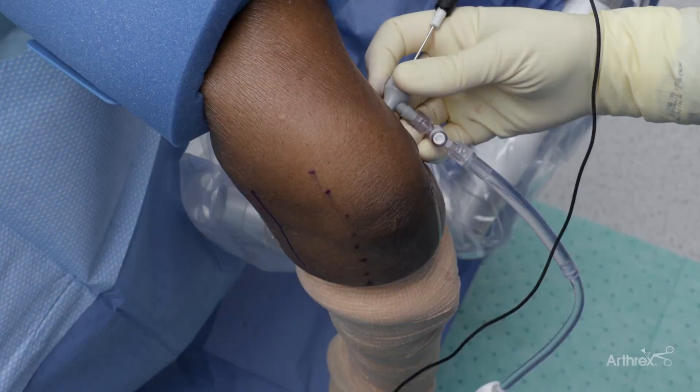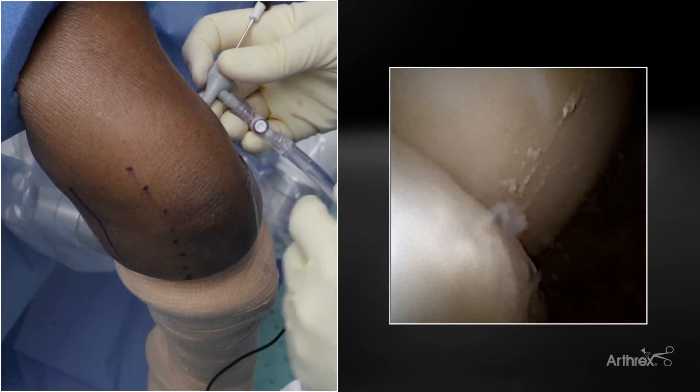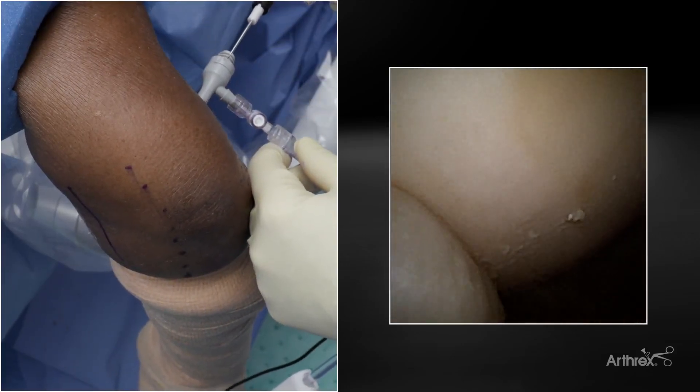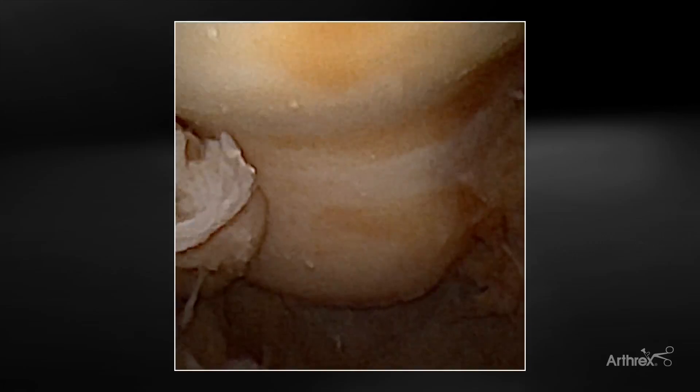You can see that we have an excellent view of the ulnar aspect. This is a zero-degree camera, so we see an excellent view of the coronoid and an excellent view of the trochlear groove anteriorly. You see the capsule anteriorly. I like to look at the ulnar side from the radial portal, and I like to look at the radiocapitellar joint from the ulnar portal. The nanoscope, because it's zero degrees and has such an excellent small profile, allows me to look all the way across and even see to the back of the joint. You can't do this with even a small joint scope.